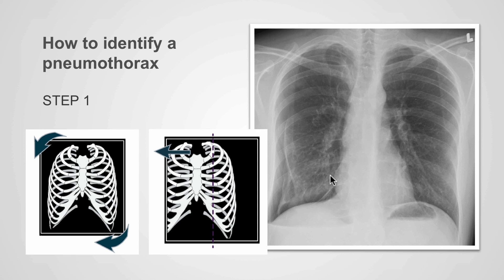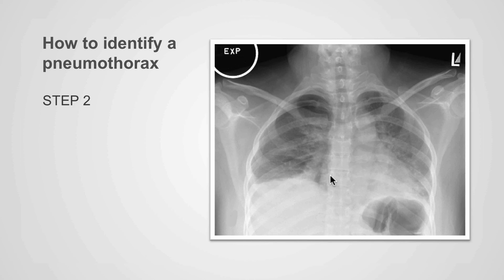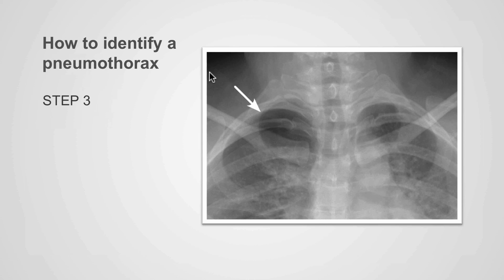So how do we identify a pneumothorax? The first step is to make sure that the patient is properly centered and is not rotated. Next we need to understand what kind of examination was performed — in this case, markers tell us this was an expiration film. Next we look for asymmetry in the apical regions, knowing that air within the pleural space will rise to the highest point. In this case, we can identify that the right apical region is blacker than on the left.